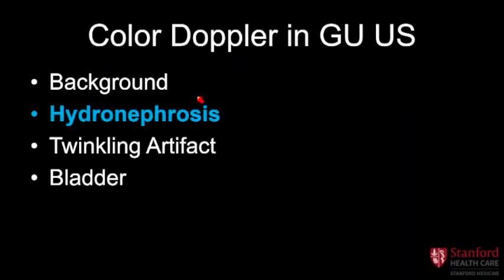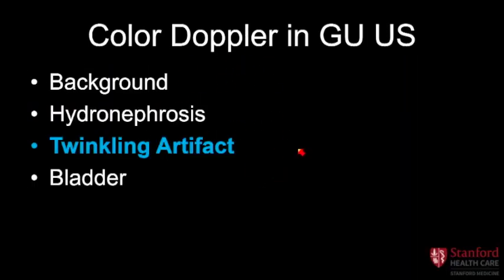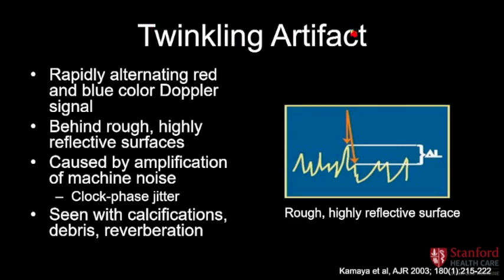Okay, so that's just a little bit about hydronephrosis. Moving on to color Doppler and twinkling artifact. It is twinkling artifact, not twinkle. I've heard a lot of people say twinkle.